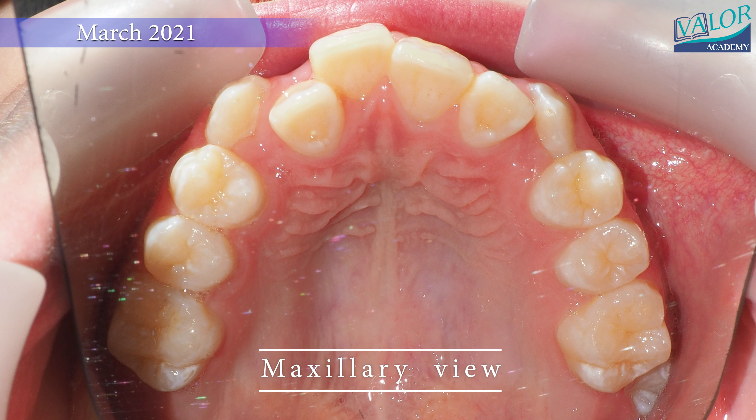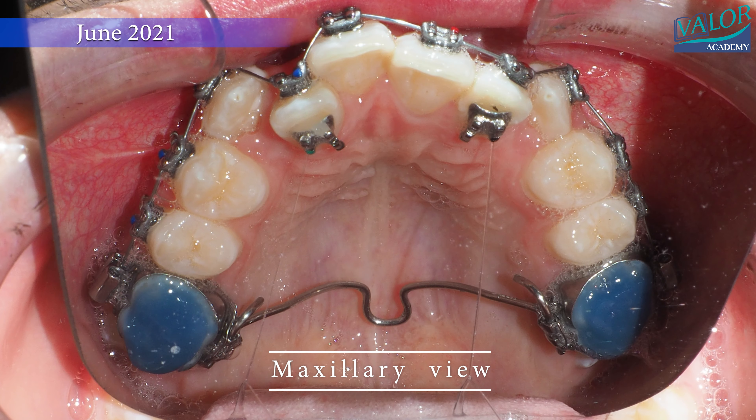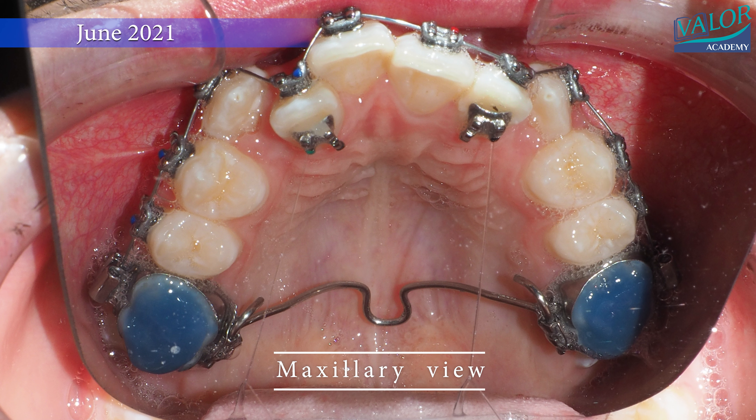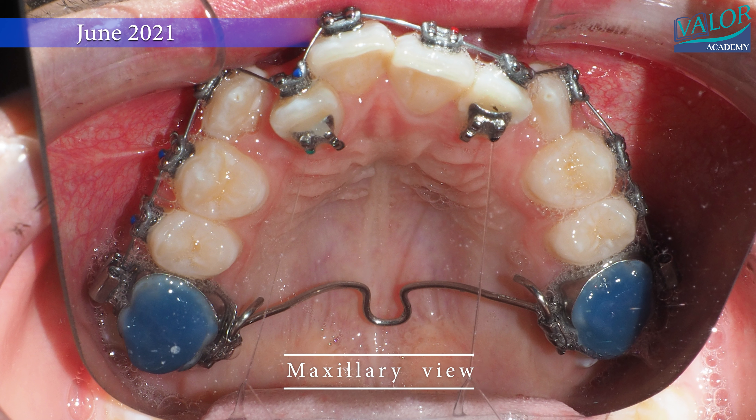In the maxillary view, you can see arch development through expansion with a transpalatal arch and teeth leveling.